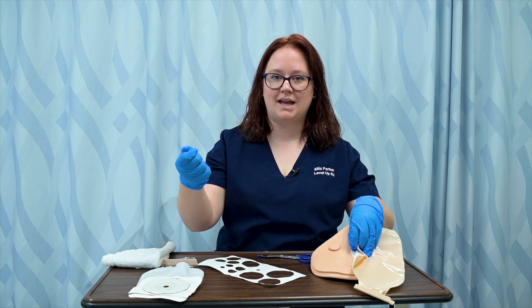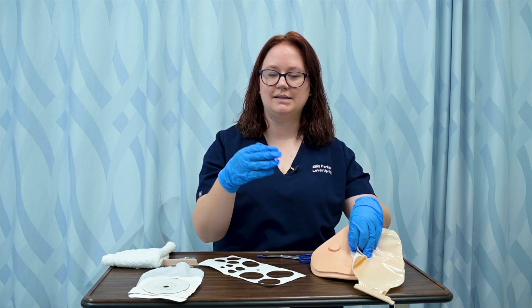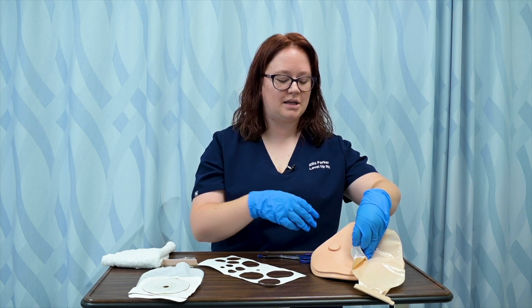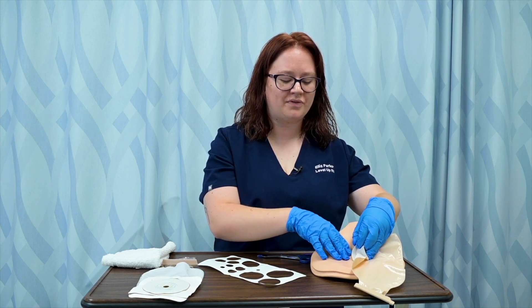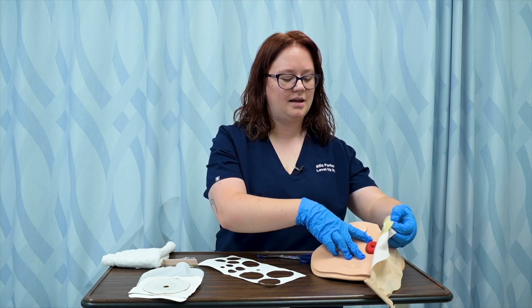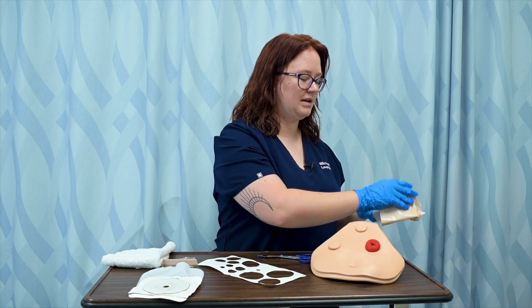I'm not going to rip it off like a bandaid because I don't want to cause any skin tears or any issues with skin irritation. So I want to remove this as gently as possible. I'm going to push down on the skin and remove that wafer, discarding it.